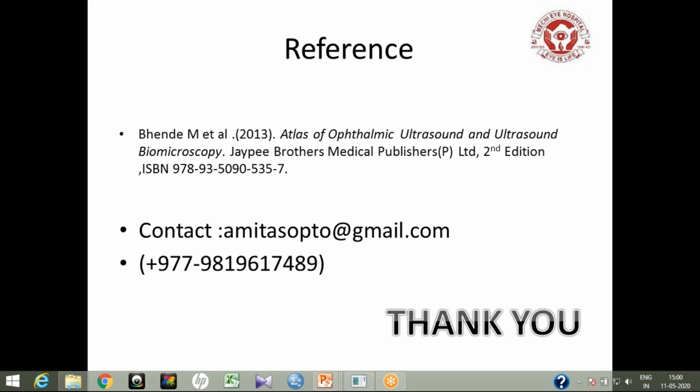Sir, how can we differentiate between exudative RD and retinoschisis by pressing with the finger, as you said? Can you please explain it again? Okay.